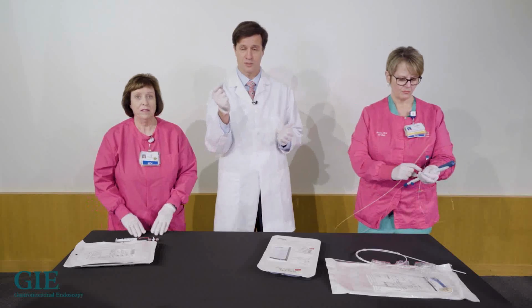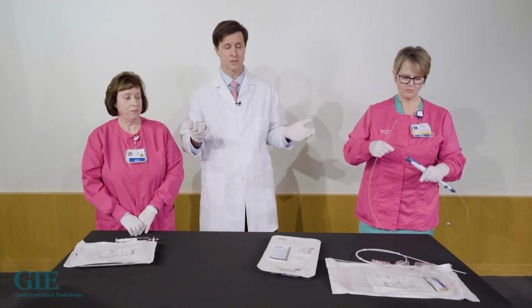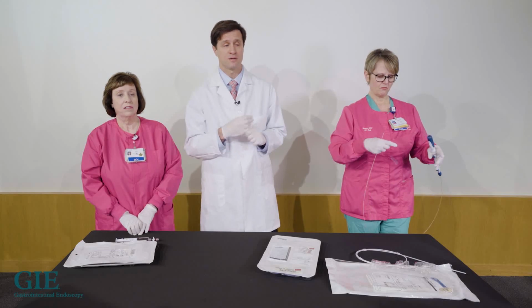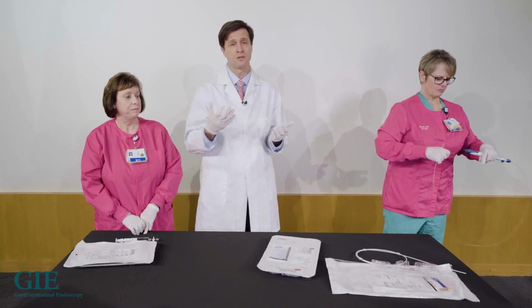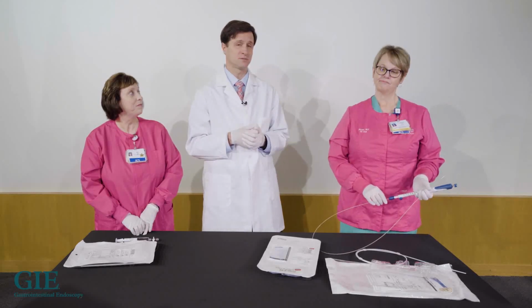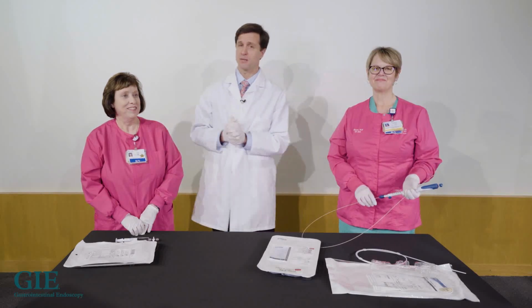I think remembering the top tips that we talked about in this demonstration today is really making sure you know what distance it's going to come out. You can obviously see it on your EUS screen. Having people that you work with that are experienced, and if they're not, letting them know what is going to happen before it does is very helpful. And then finally, when you want the right piece of tissue, remember you should feel that tactile sensation, both you and your nurse or technician, to make sure you have an adequate piece of tissue. And the good news is you'll know, because when you go to put it in the container, you'll see it. And if you don't, you try again. So thank you very much.